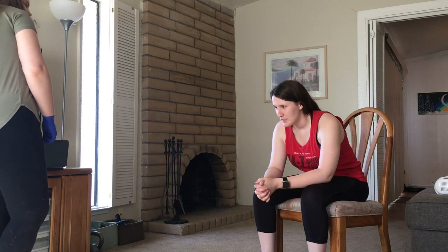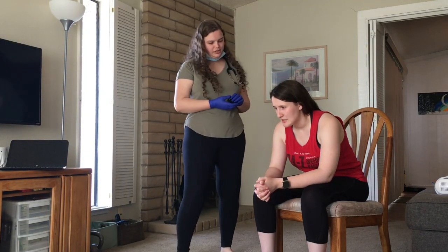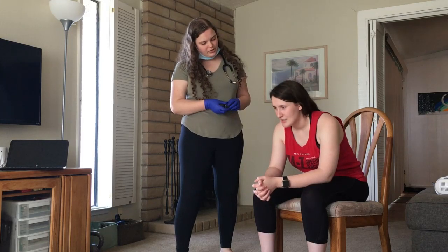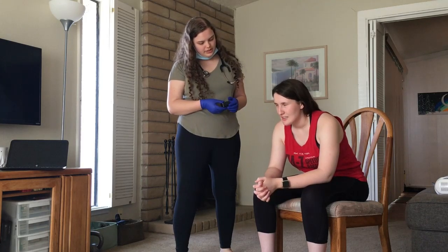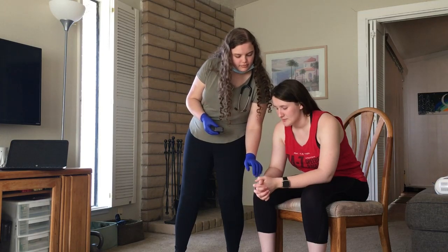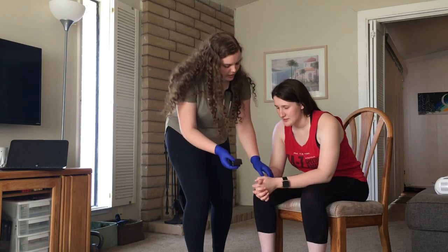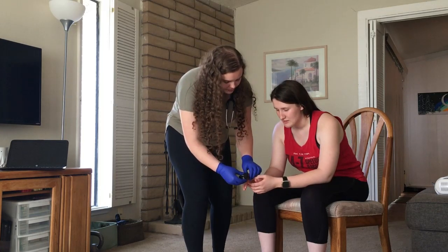Alright. Hello, my name's Melinda. I'm with Respiratory Therapy. I'm here to assess you. Can you tell me your name and your date of birth, please? Rachel Atkinson, 9/10/97. Alright, thank you. How are you feeling today? I can't breathe. I'll put this pulse oximeter on you.